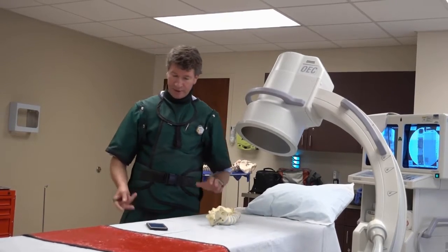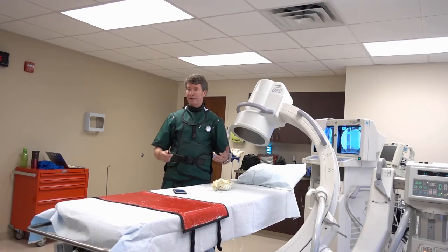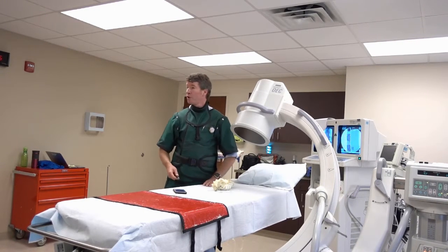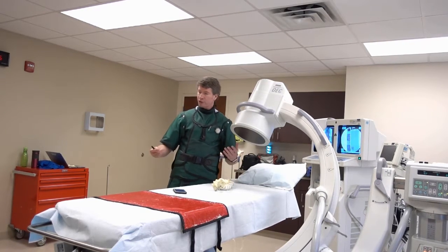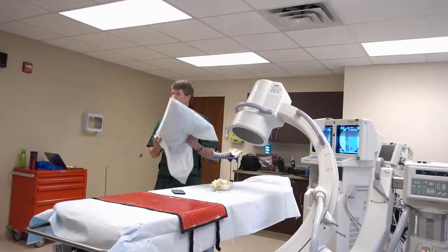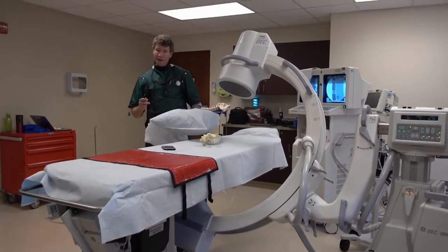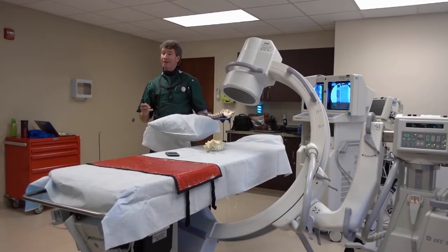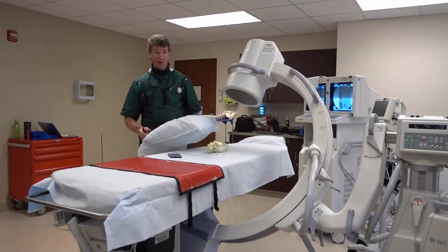But the positioning is everything. It's also important to keep the patient comfortable. Sometimes they refuse to even roll over, right? Because it hurts them too much to lay in that position. So for the most part, I can kind of get around that. The one time that I really want to make the patient, I don't care about the patient's comfort as much, is when I'm putting in a spinal cord stimulator.